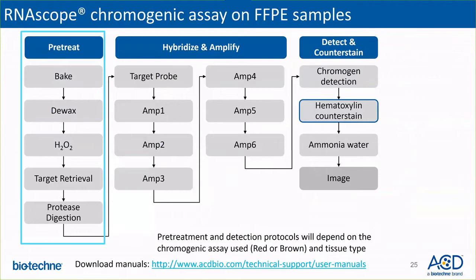The workflow for both FFPE and fixed frozen samples requires a heat-mediated target retrieval step followed by protease digestion for pretreatment. The workflow on the Leica Bond RX and Ventana automated systems are very similar to the manual assay.